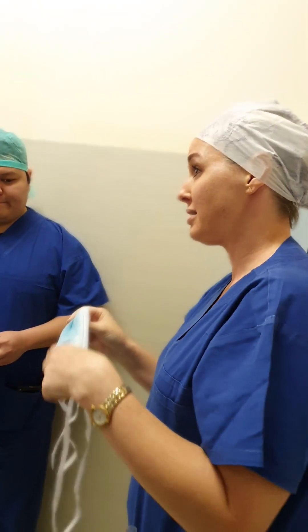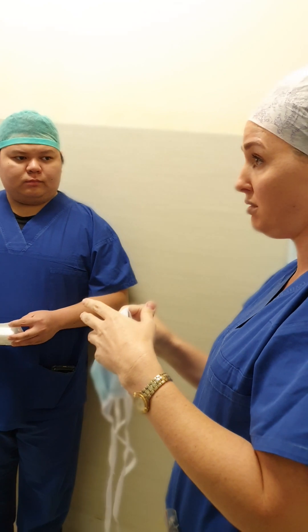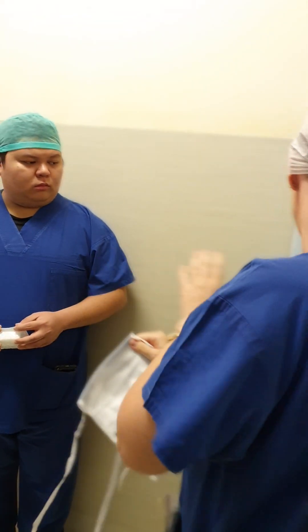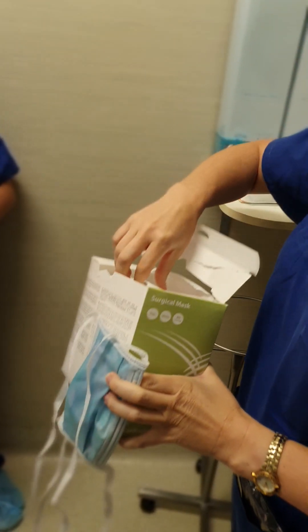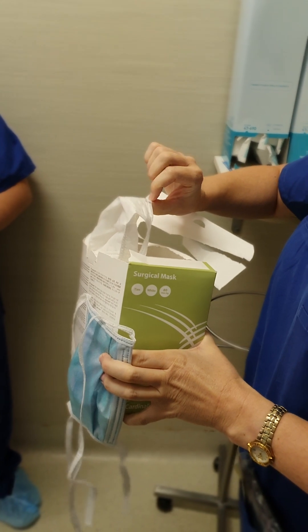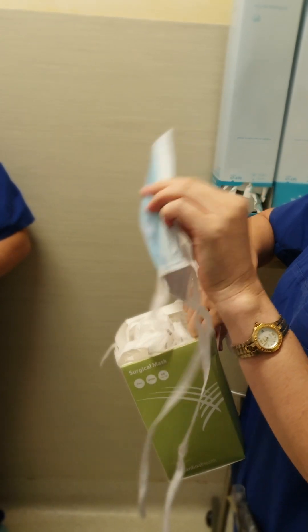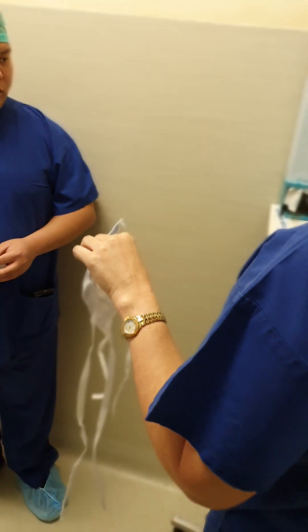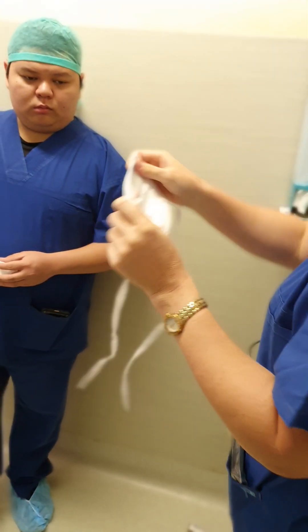So, selection of the masks. We're in an aerosol-generating procedure. Level three masks is what you would select. These are not appropriate for the operating that we're going to be doing — not even for your scout nurse. They must be wearing one of these if we're going to be an aerosol generator. So you would come out and select your appropriate mask, which is this one.